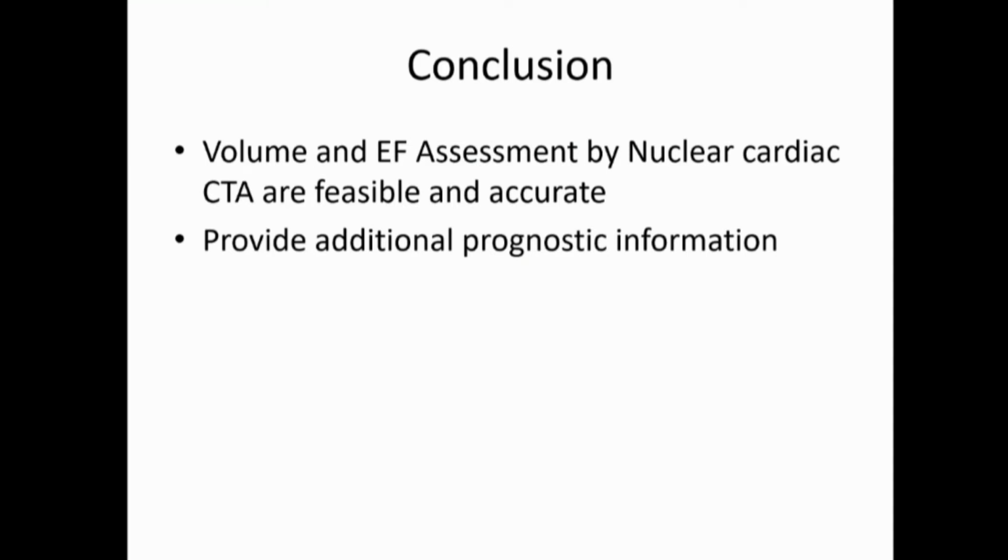There's no question, because of the radiation and the temporal resolution, MRI is a lot better than CT. But I think about it for the research setting. I think this single threshold, large detector CTA-derived LV size could offer something interesting for research purposes. Okay, thank you. That's all I have.